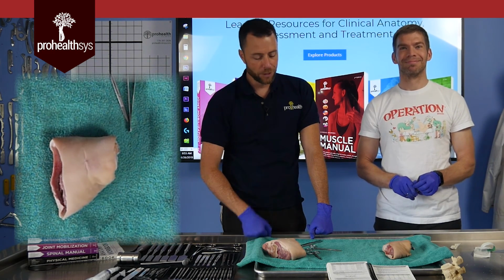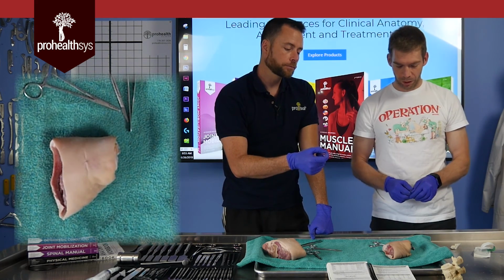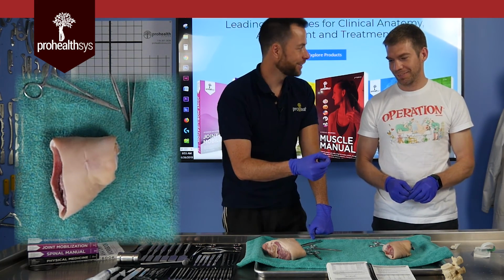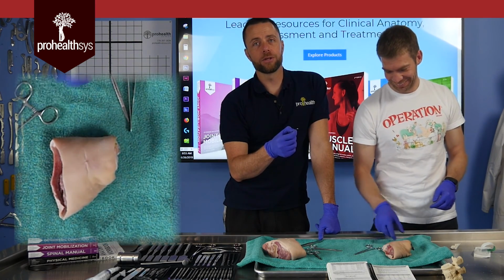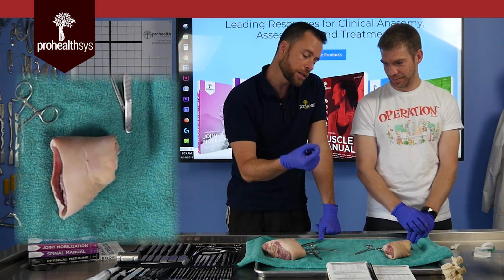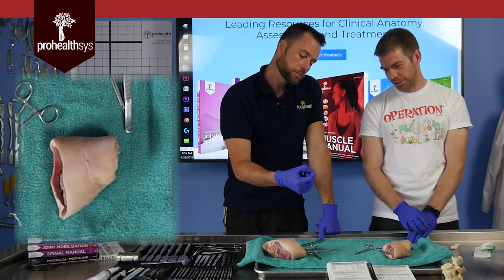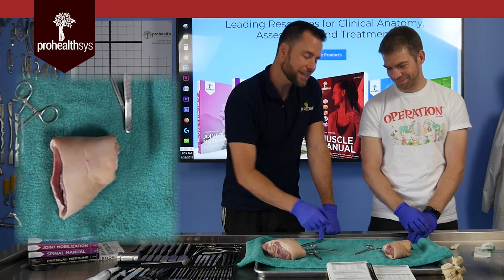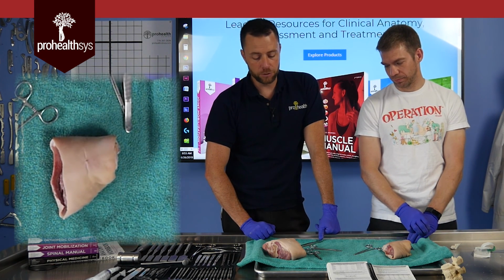One other thing that I will point out is, of course, what do we do with this, Dr. Vargo? You stick it into your partner. Okay. Are you ready? So, of course, you're going to put this into a sharps container when you're finished. And you can cycle through. How many do you think you can do off of one loop like this? You could probably do 7 or 8 stitches off of one loop like that. It's not that they're expensive, but we just don't want to be wasteful, so try and use as much of your suture material as you can.